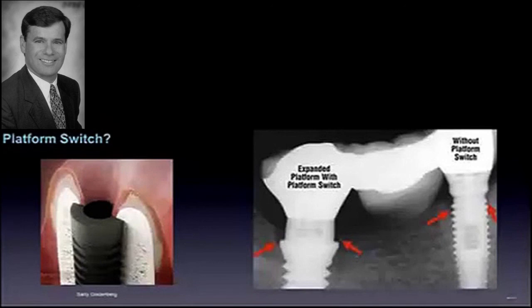And no argument that the better the connection of the abutment to the implant, the more likelihood you're going to get bone on the platform. If it was a leaking margin, the bone would never form on the platform. So when you look at 3i's pictures and you look at these platform switch designs, I think it's quite different when you have a design that actually encourages bone to grow on the platform.